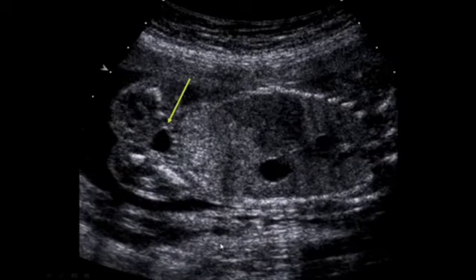So here is a view of the fetus, a normal fetus. Typically we'll see the bladder in the pelvis by the end of the first trimester in all fetuses. Here's the bladder, here's the stomach, here's the liver.